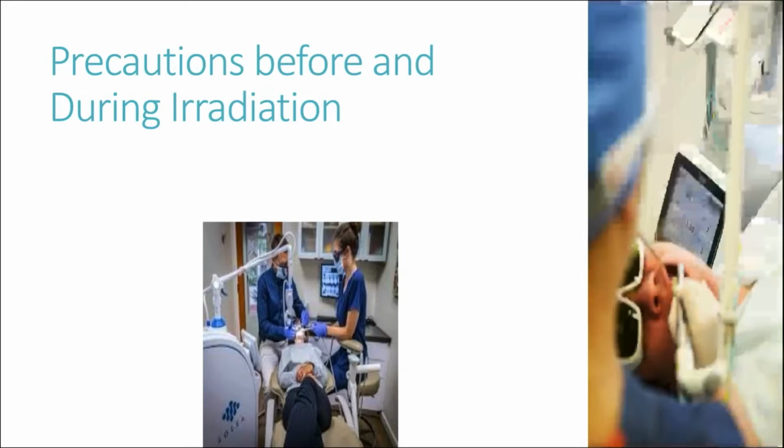Action in non-contact mode, and protect the patient's eyes, throat, and oral tissue. Use wet gauze to avoid reflection from shiny metal surfaces and ensure adequate high-speed evacuation.